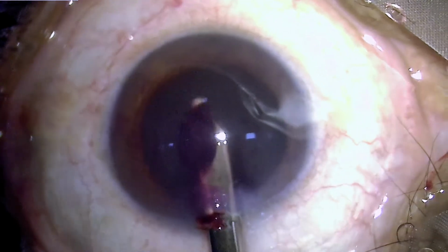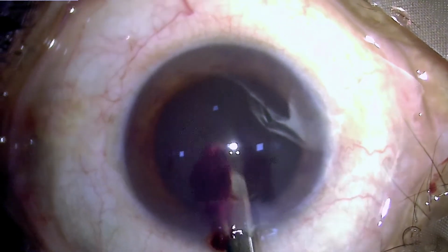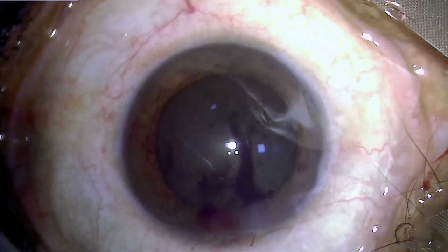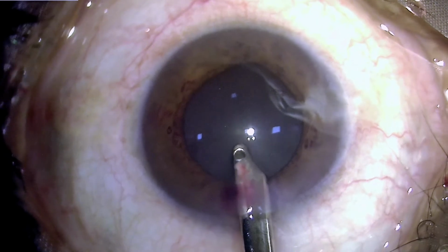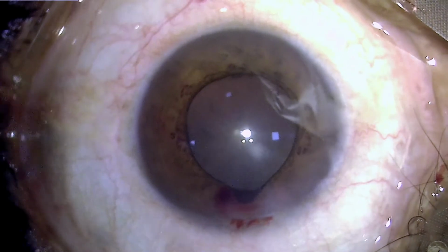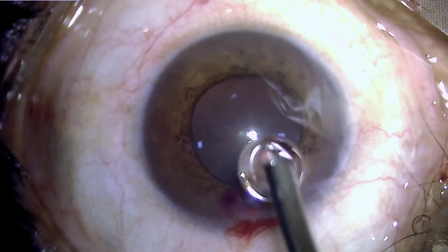So it's a repeated procedure which needs a lot of patience. Otherwise, if the wound had been made larger, we could have removed it in a single go, but then there would have been a possibility of causing collapse of the chamber and some damage to the tissues. Now the anterior chamber has been cleaned and there is some amount of iris prolapse in the wound which will be repositioned later on. There is some cellular level of contamination of the aqueous with the blood, which will need either a wash or flushing.